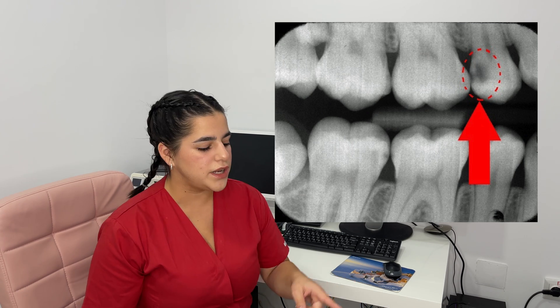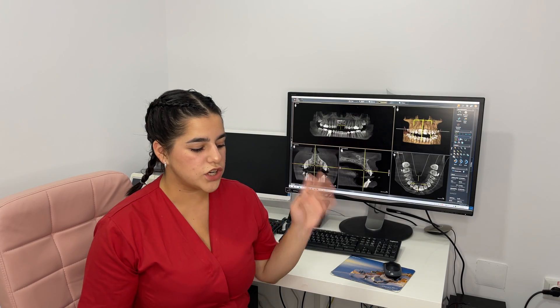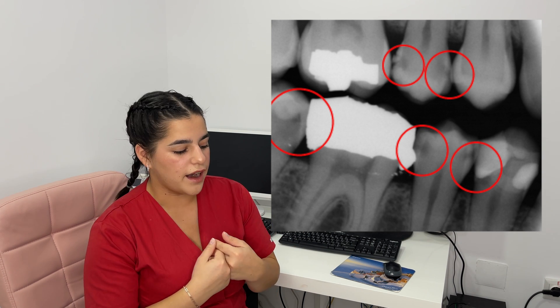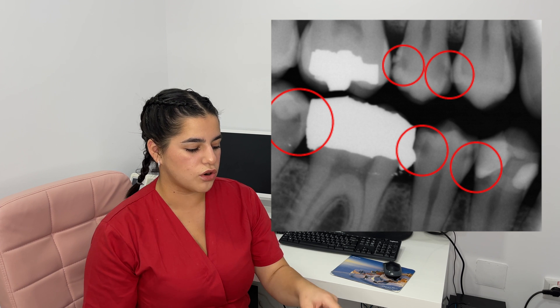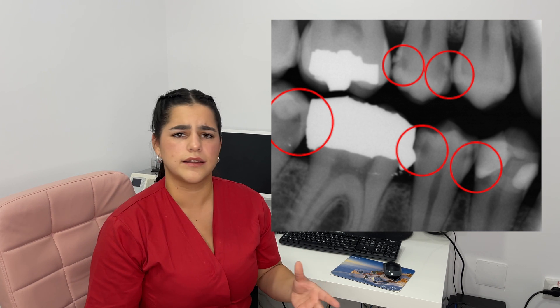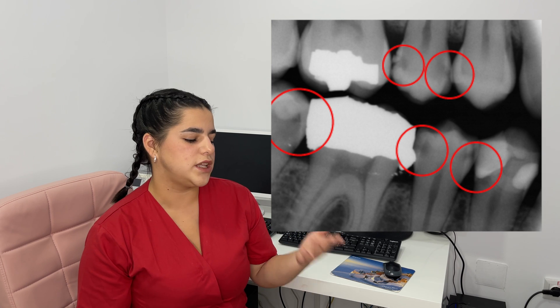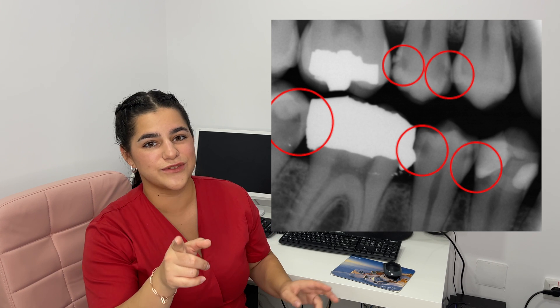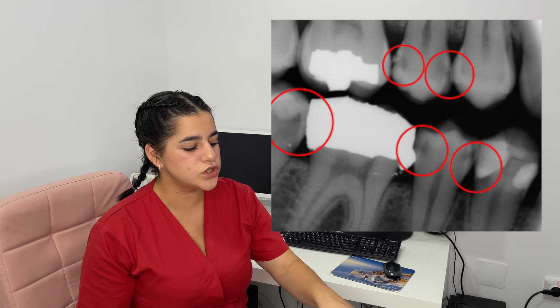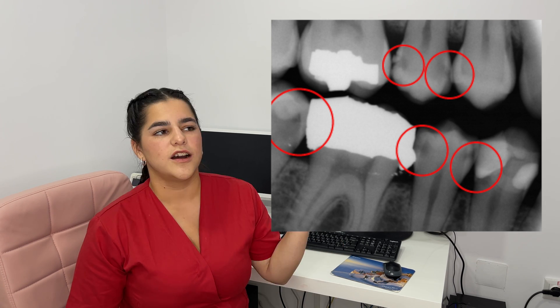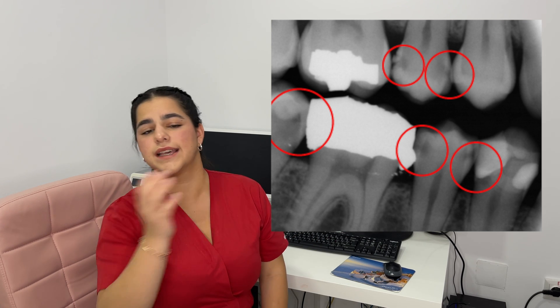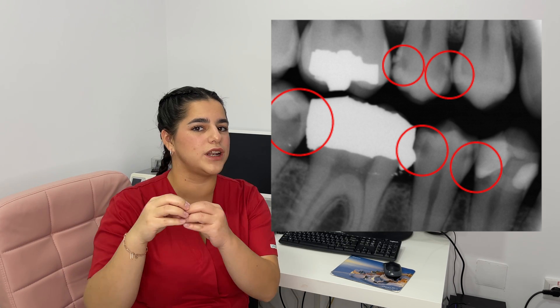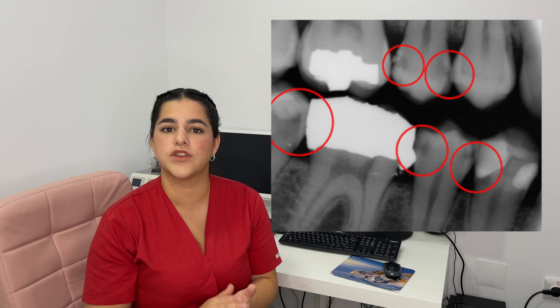In the second picture we see a lot of interdental cavities — basically at the contact points with adjacent teeth. All the circled areas show cavities. These are a little smaller and won't need endodontic treatment; you'll just need to fix them before they get worse. Get yourself to the dentist if you have any pain. For example, on the upper premolars, when one premolar is missing, you might have a distal cavity on the first one as well. They're usually mirrored, so always take the x-ray before you start treatment.